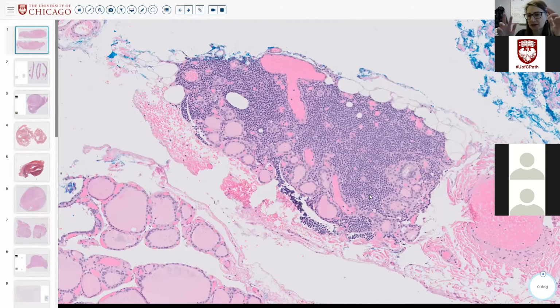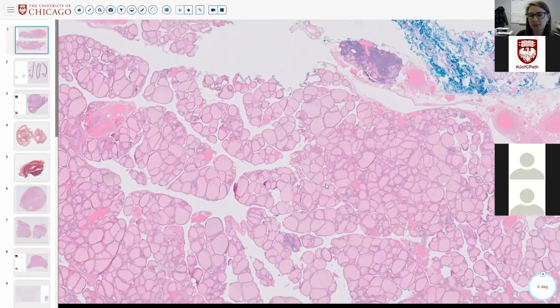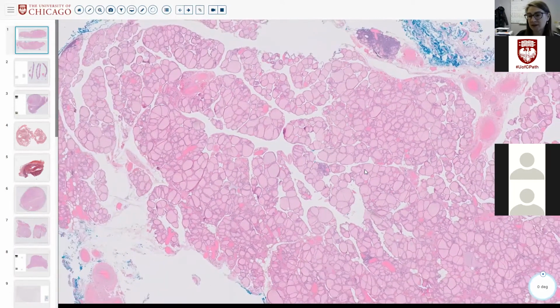These are called parasitic or exophytic nodules. I didn't specifically put that slide on here for this, but here's an example of it. You're going to see it in practice, and potentially at the time of frozen. It more commonly happens in Hashimoto's thyroiditis, where there's tons of inflammation and these little nodules pop off. They auto-amputate themselves. But okay, good, just to think about.